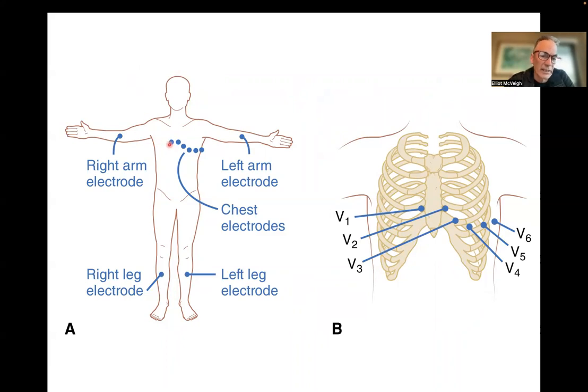If it's a 12 lead EKG, you're doing a sort of high resolution map of this because you suspect the patient has heart disease, and you might do this while they're under stress. Oftentimes, if they come in with chest pain, they'll put on a 12 lead EKG to take a look. And so there's an extra 6 leads across the chest. So you get a very high resolution picture of the lead differences right over top of the heart itself. And ideally, these are their locations with respect to the ribs and the patient's chest. And there's also a lead on the right leg.